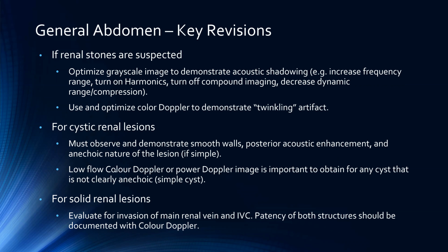And then it's also always critical to include a color Doppler or power Doppler image of those cysts to demonstrate that there is no internal vascularity.